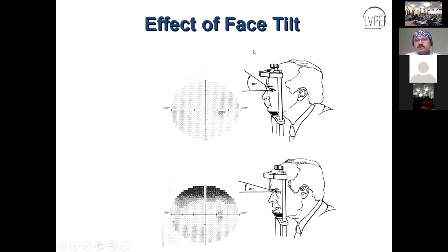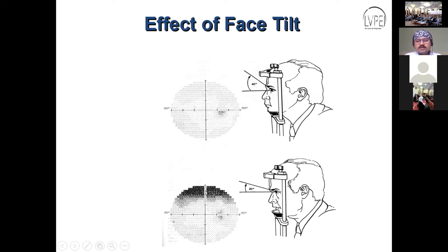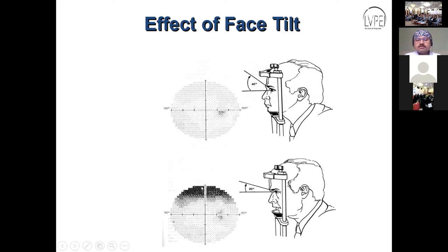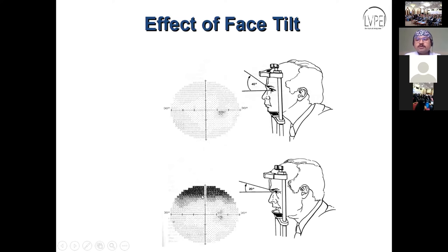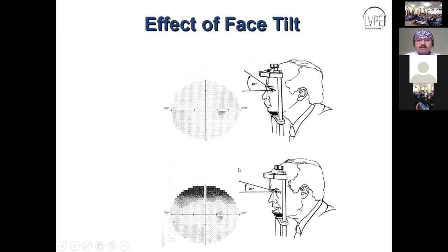Here is the effect of face tilt, which causes a superior field defect. As seen in the picture, when the patient's chin is not properly aligned, the brow causes a superior field defect. The effect of face tilt can cause a superior defect, and vice versa — if the patient's chin is not in the proper position, we'll discuss further in subsequent slides.